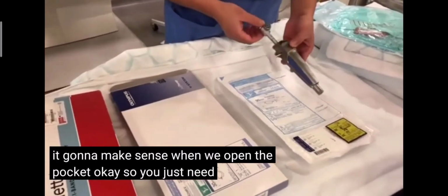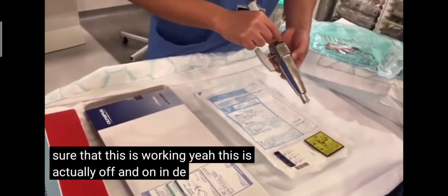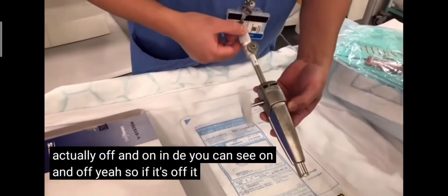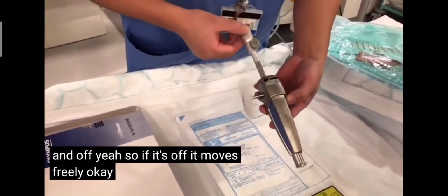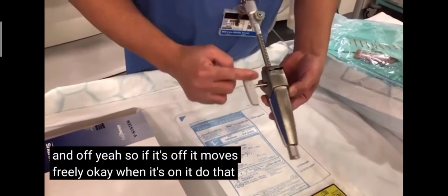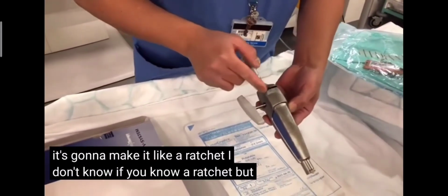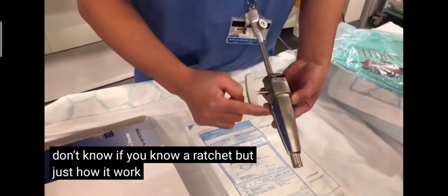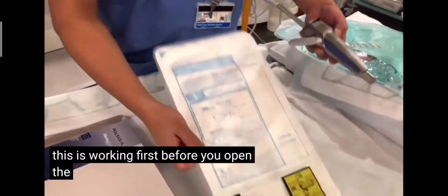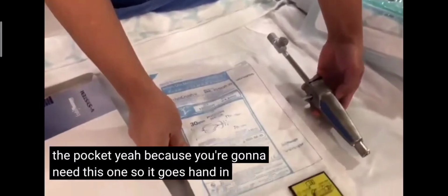You just need to make sure that this is working. There's actually off and on in there. You can see on and off. If it's off, it moves freely. When it's on, it's going to make it like a ratchet. I don't know if you know a ratchet, but that's how it should work. Make sure that this is working first before you open the pocket, because you're going to need this one, so it goes hand in hand.